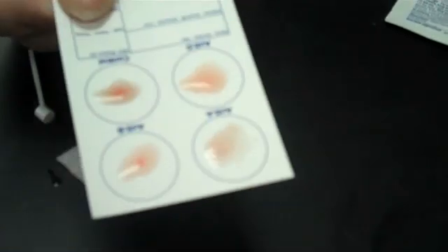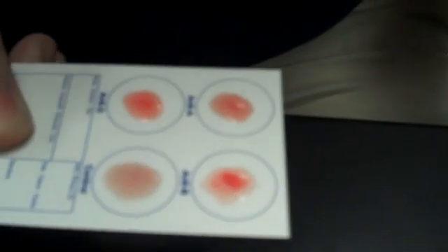I can see clumping on the A right away on yours, and yours looks like clumping on the B. Where it says anti-D, that's for your RH factor — if it clumps there, that means you're positive.